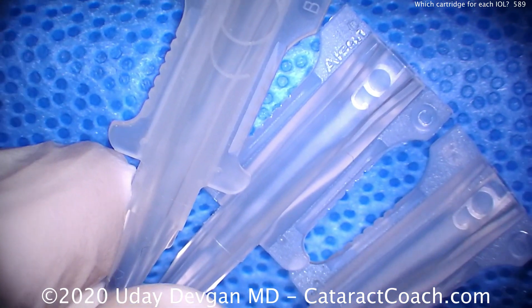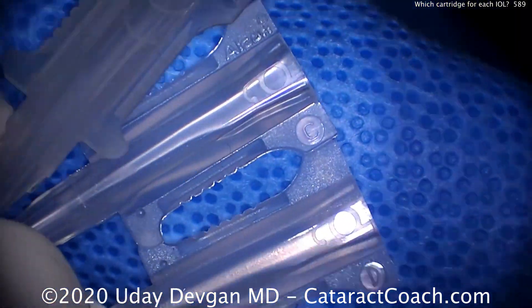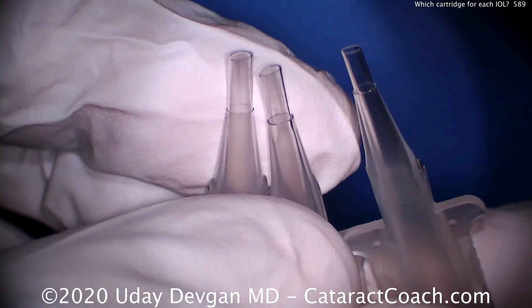Now these are all made by Alcon and are designed for their lenses. But here's a secret: you can put any three-piece acrylic lens through that B cartridge, and you can put any single-piece acrylic lens through that C cartridge.